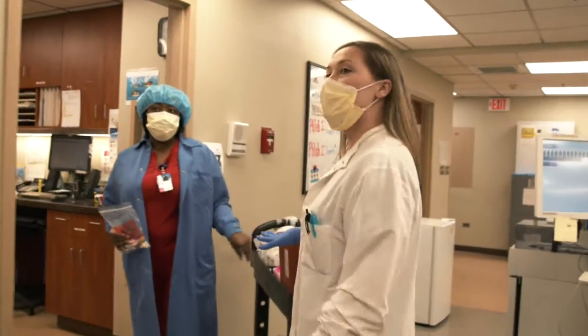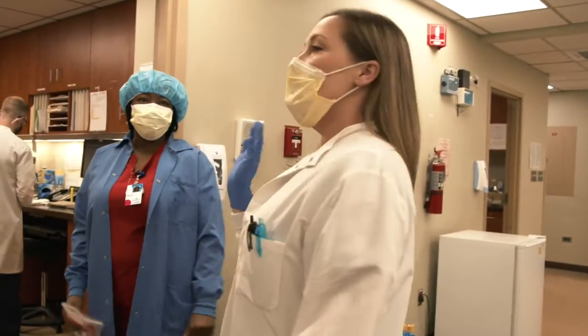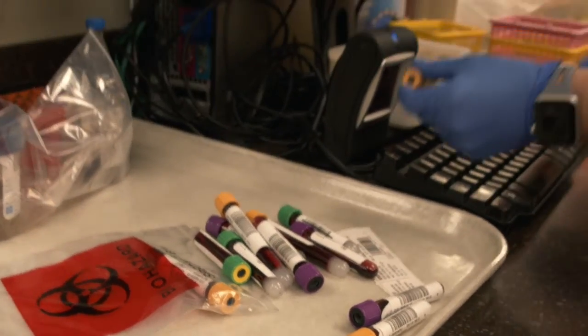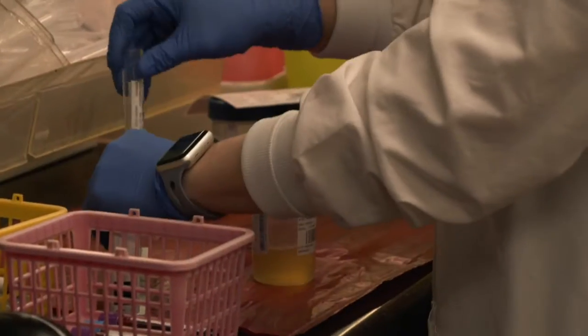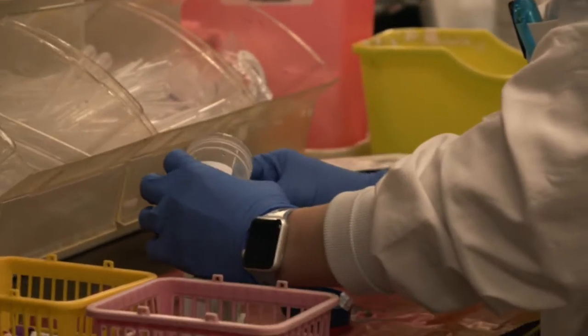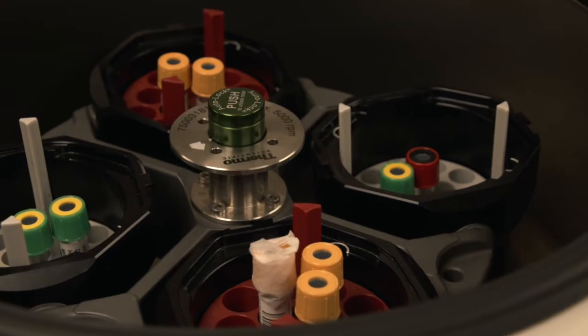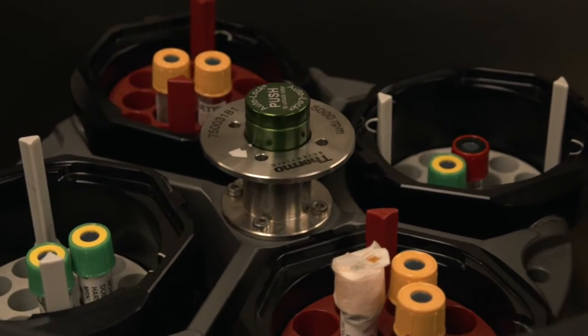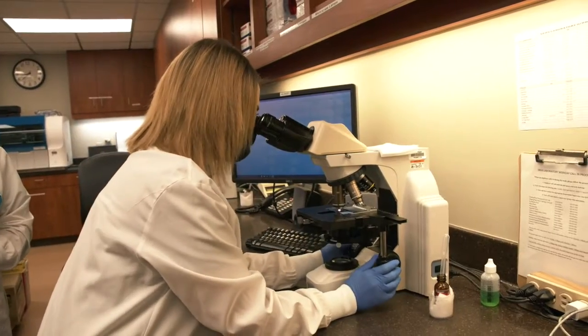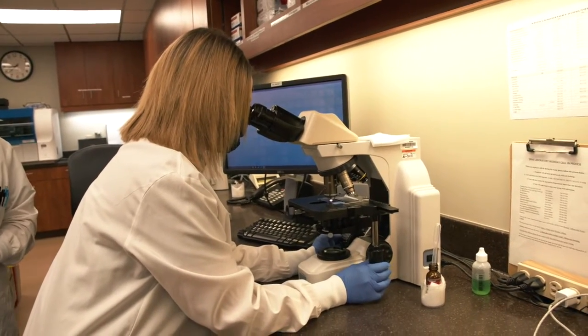What we do is we receive specimens here in the laboratory. We check them pre-analytical for all the accuracy that needs to be there to ensure appropriate testing. They're delivered to the different technical departments. They're put on these amazing analyzers we have, high technology. We perform those tests, and then they're also reviewed post-analytically by our technicians before they're released to the physicians.